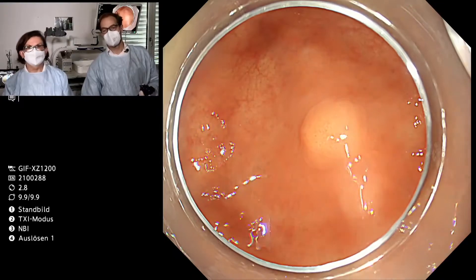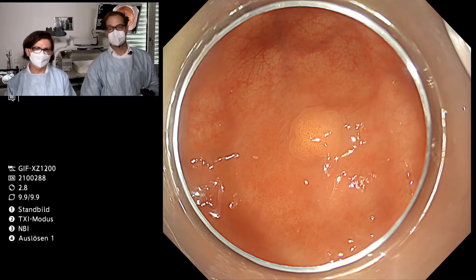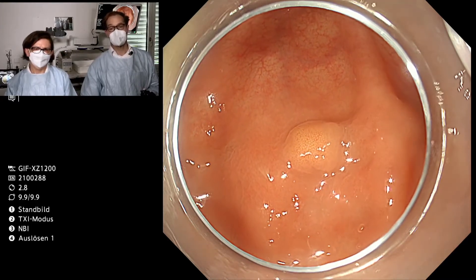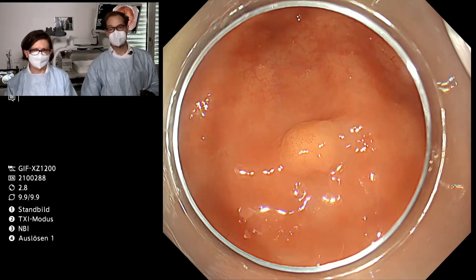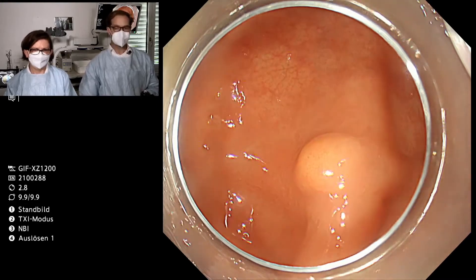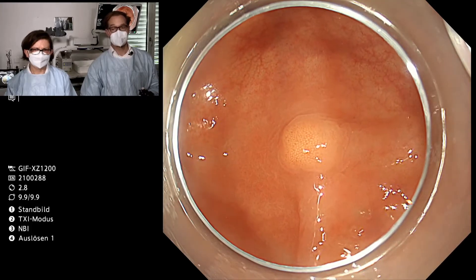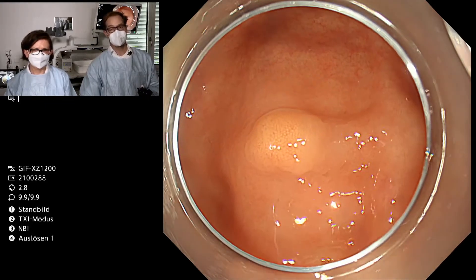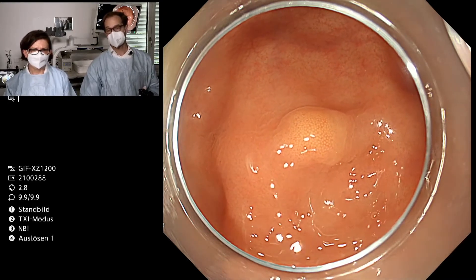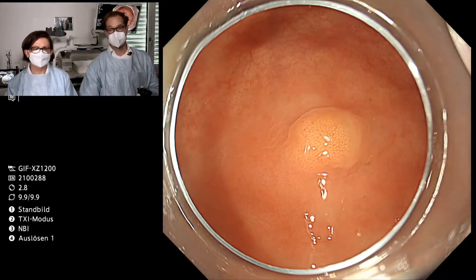This lesion is highly suspicious for a NET tumour and the question is how to treat such lesions. It's a very small lesion below 10 millimeters. We could go for standard EMR but there is a high risk of R1 resection. ESD technique may be a bit overdone — it's a long procedure with high risk of bleeding and even perforation. Full thickness resection is a very good method but also cost-intensive and maybe an overtreatment for such a small lesion.